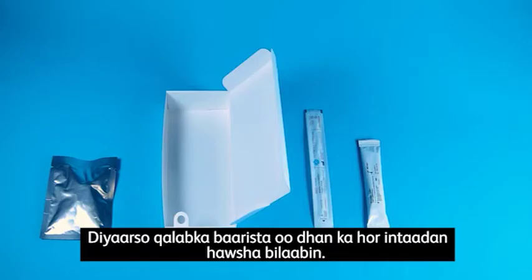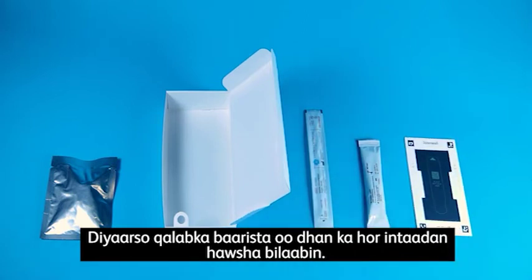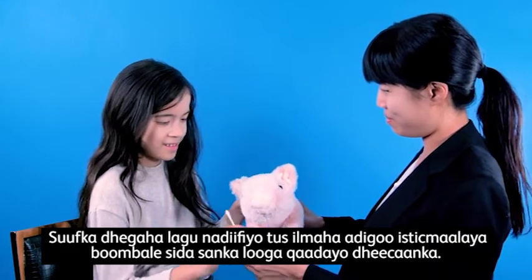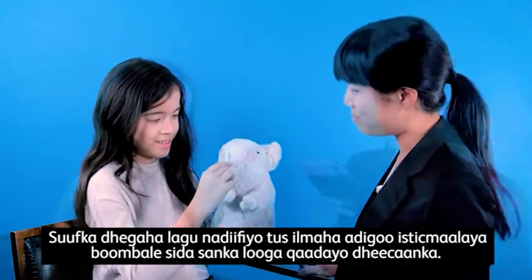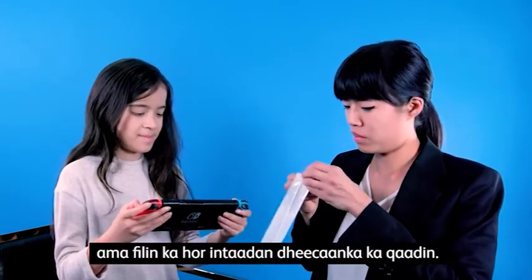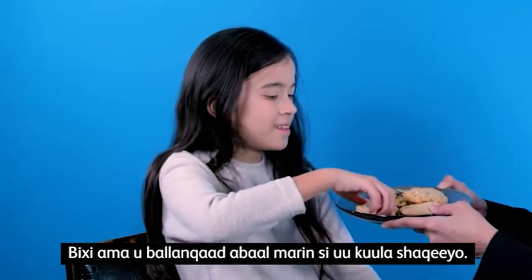We recommend the following techniques: have all test supplies ready prior to collection. Have a caregiver demonstrate pain-free collection on a stuffed animal using a household Q-tip. Use an iPad or iPhone to play music, a video game, or a movie to distract the child prior to collection.